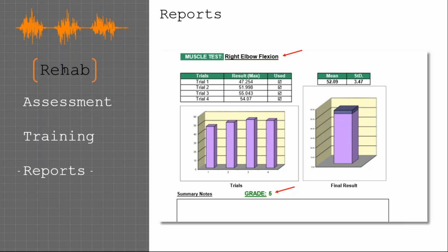And it also shows you, again, when we talk about the customizable portion, if there's something that's going to be valuable to report to your clients on a day-to-day basis that we want to be able to report, we're able to do it. So we're all for working with you to get the tool to work the way you see it in your mind. And we have different avenues that we can go down to address that.